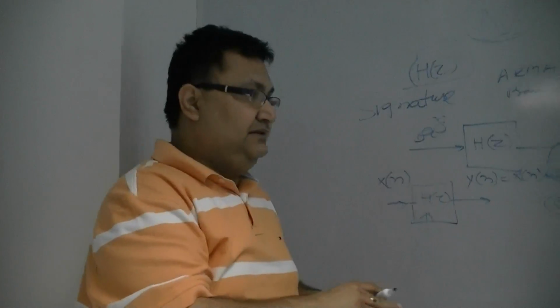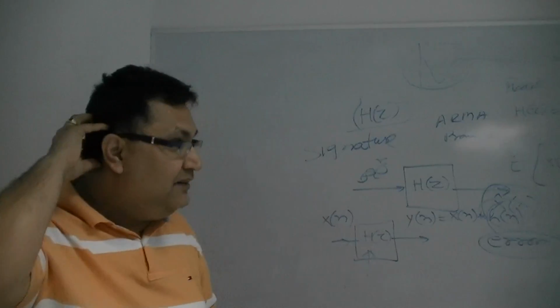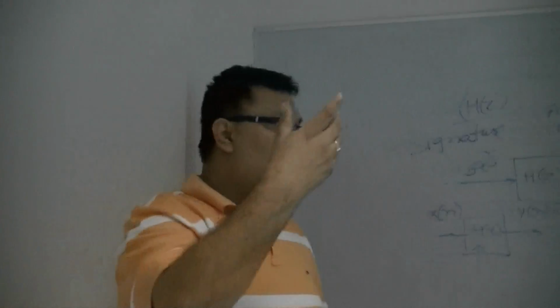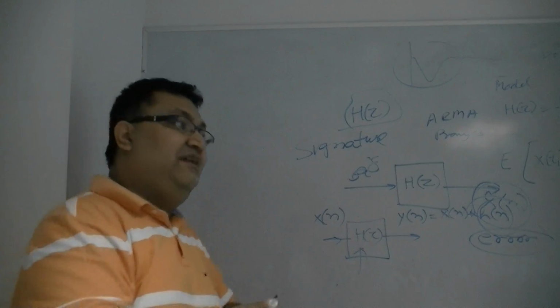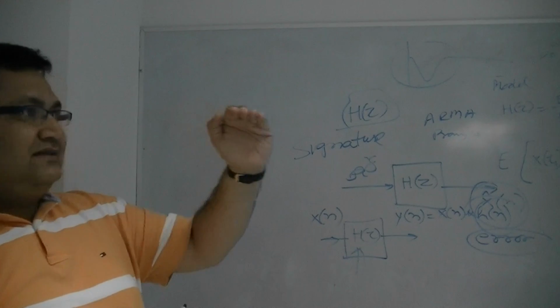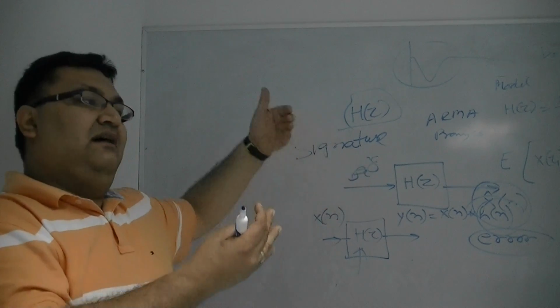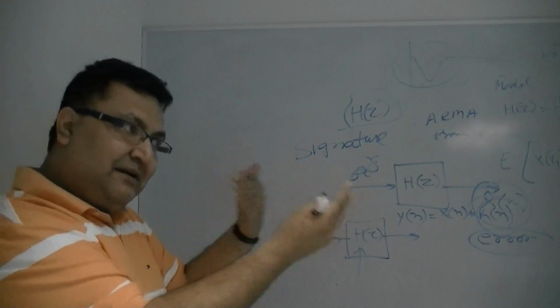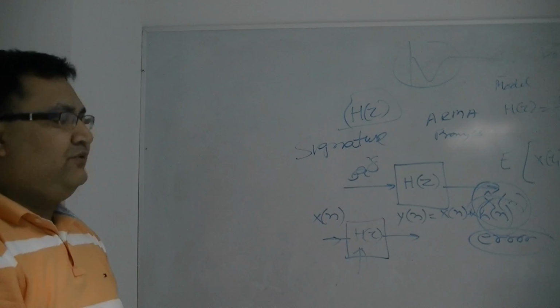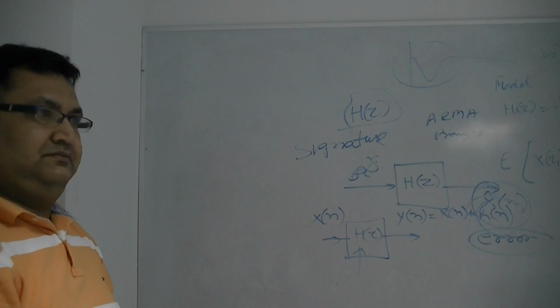Suppose I am doing the thought process. Thought process has a different part of the brain. Blinking has a different part of the brain, so different channels. By checking, okay, this channel is giving me this signal. If I have a standard signature of that one, I can just compare. So I'm trying to create the signatures. How do you compare this?